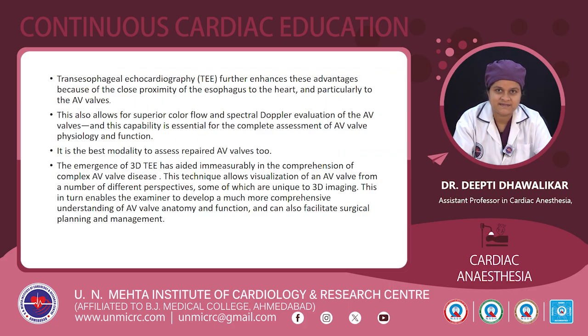TEE further enhances these advantages because of the close proximity of the esophagus to the heart and particularly to the AV valves. This also allows for superior color flow and spectral Doppler evaluation of the AV valves, and this capability is essential for the complete assessment of the AV valve physiology and function. It is the best modality to assess repaired AV valves too. And further, the emergence of 3D TEE has aided immeasurably in the comprehension of complex AV valve disease.